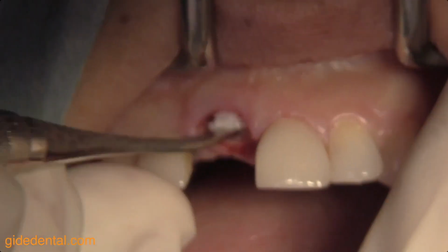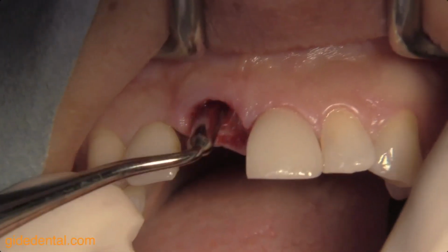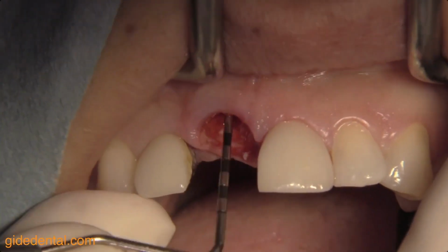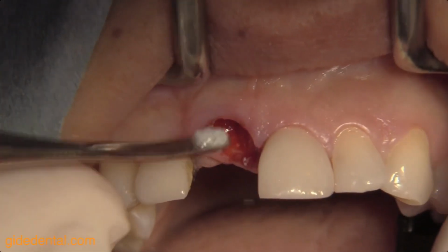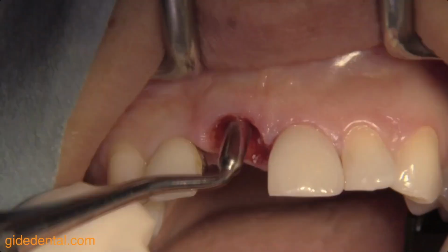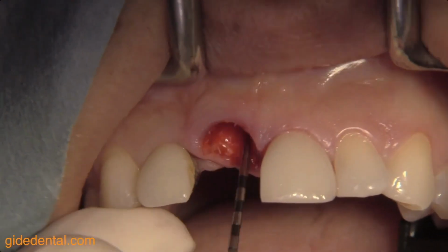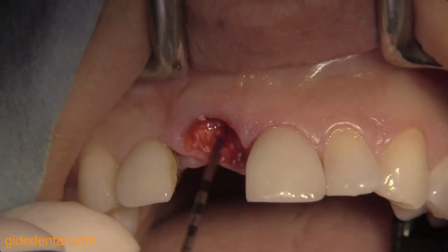I've used here in this patient a biomaterial made out of xenograft, and that's the commercial brand BioOS. And you can see small particles that I'm using here, not the large particles. And just with small volume, I'm applying them to fit around the implant and exactly into that gap.